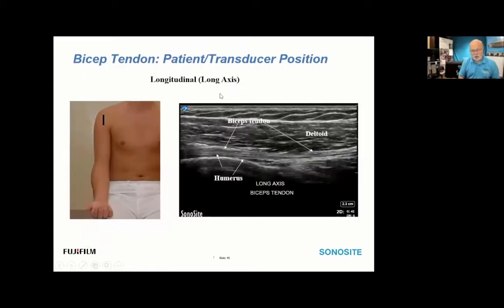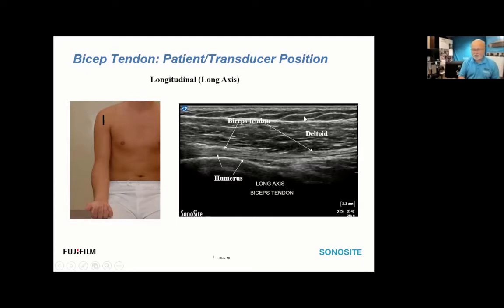Once we've looked in short axis, we flip the transducer 90 degrees to see the longitudinally oriented fibers of the long head of the biceps. You see the bony signature of the humerus deep, the fibrillar pattern of the bicep tendon, the more pennate pattern of the overlying deltoid muscle, a superficial fatty layer of tissue, and the skin.